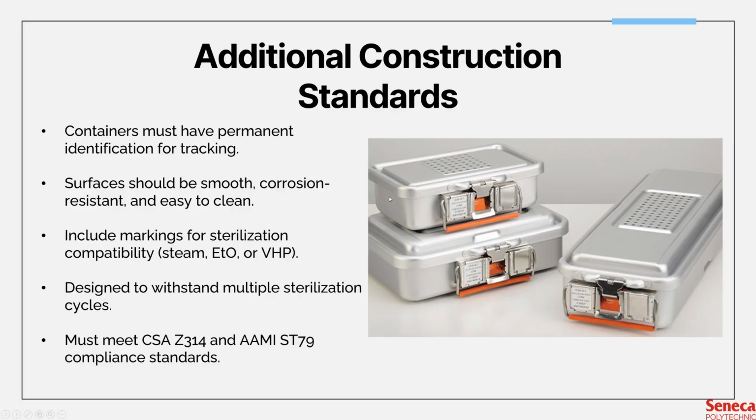Of course, all surfaces must be smooth, corrosion resistant, and easy to clean. Every unit must be designed to withstand repeated sterilization cycles without losing shape or function. And of course, all models must comply with CSA Z314 and AAMI ST79 standards to ensure reliability in the healthcare environment.